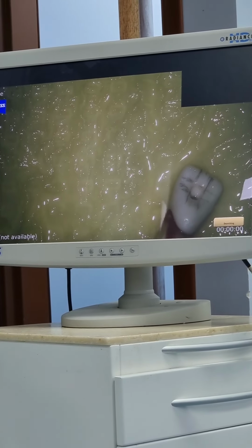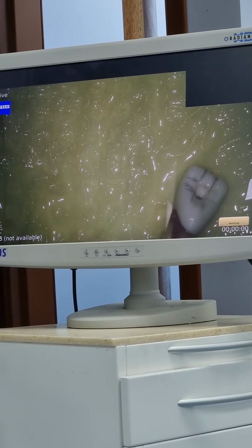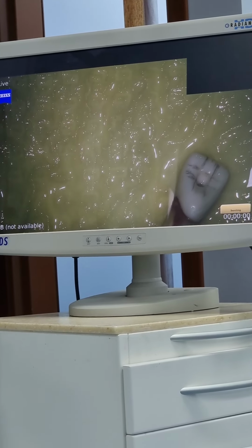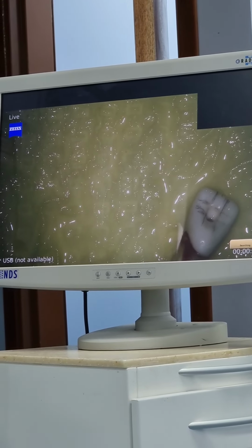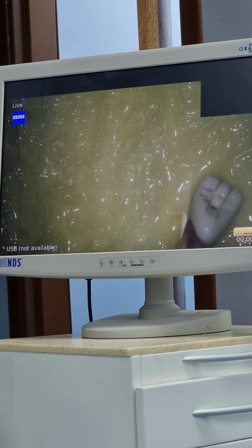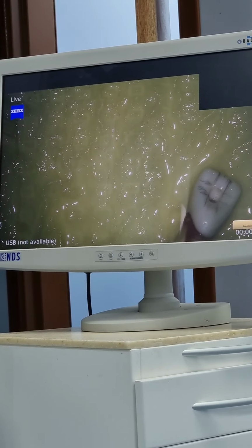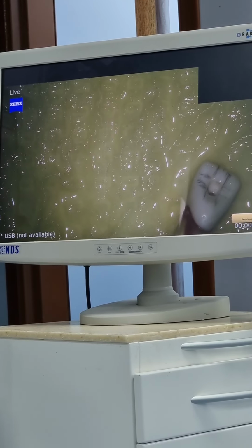So what we are doing is going inside this roof. Suppose this is the crown, and this is the pulp chamber inside. What is happening is the round bur is first going onto one point. It is just entering one part or one point in the roof.